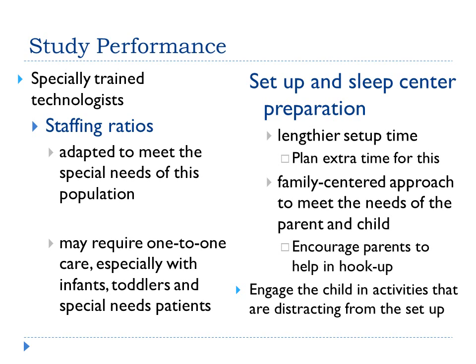For your setup and sleep preparation, expect a lengthier setup time, and just plan extra time for this. Maintain a family-centered approach to meet the needs of the parent and the child. Again, encourage the parents to help in the hookup. And as you're hooking up, engage the child in activities that are distracting from the setup. Make it a game, make it something fun for them. Maybe they get to choose which color of electrode to put where, or where the next electrode's going to go, and whatnot. Let's go on to our next slide.